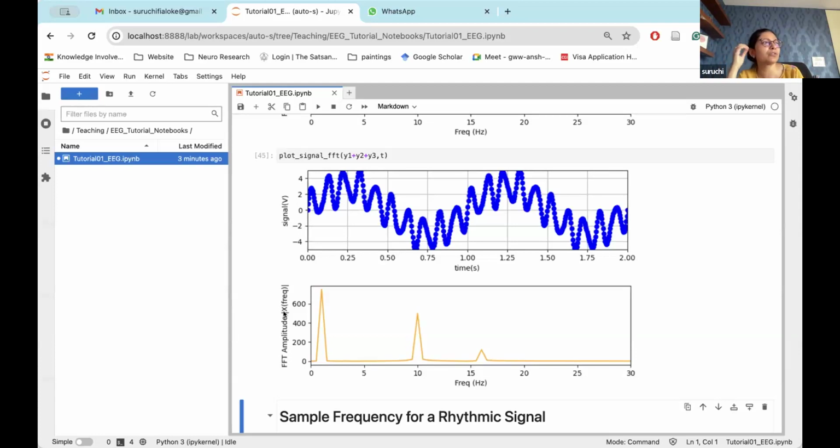And I don't think you need to get too much into the maths. It is a summation, e to the power minus i x t, dt, but I don't need that. The programming does it quickly, so I don't need to delve into it. The continuous one is needed if you dealt with just sine x. Sine x has a property, and when you do integration of sine x, you'll get cos x, those kind of things. Those are continuous things, but the data we collect is only discrete. It's always going to be discrete. So you can focus on the discrete part.